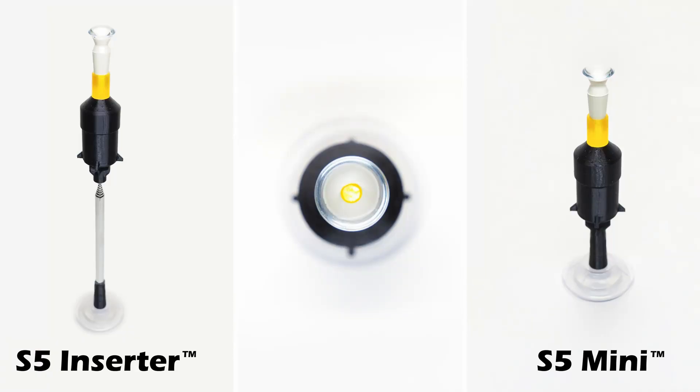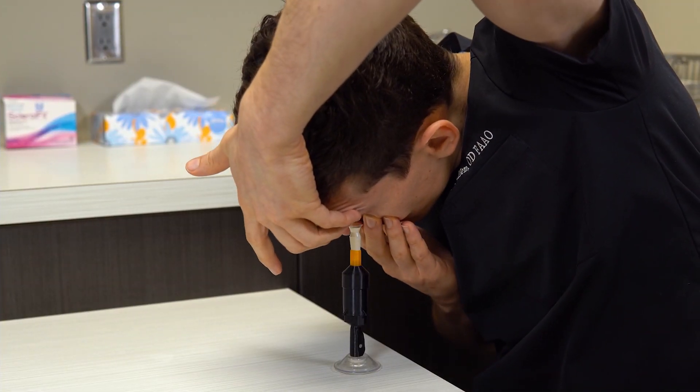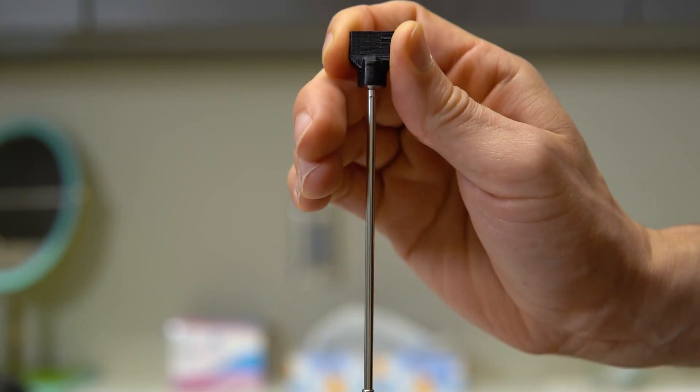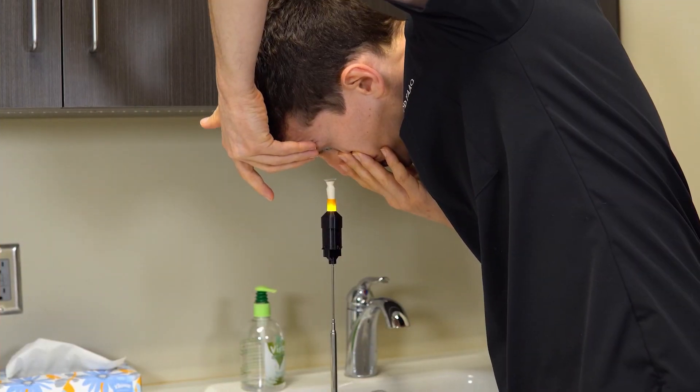The system comes in two versions: the S5 inserter and the S5 mini. The S5 mini features a compact design which is optimized for inserting the lens while sitting down, whereas the S5 inserter features an adjustable arm which is optimized for insertion of the lens while standing. Let's take a look at how to insert a scleral lens while using the S5 system.